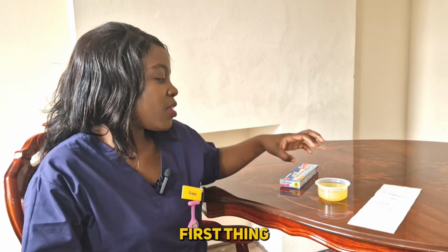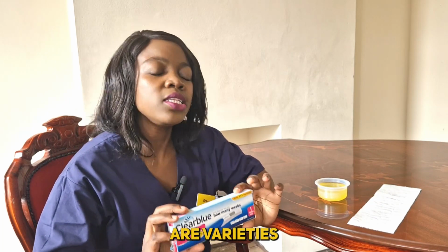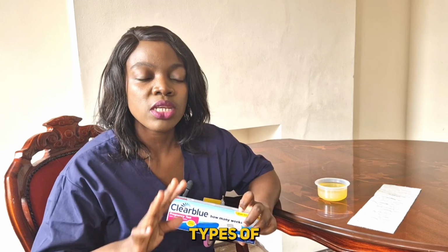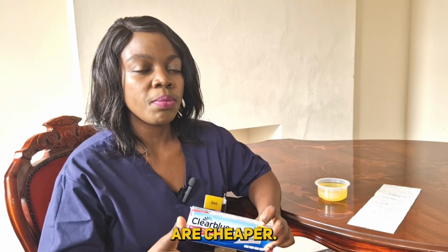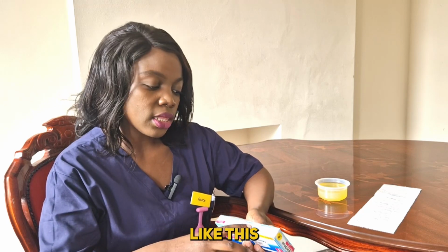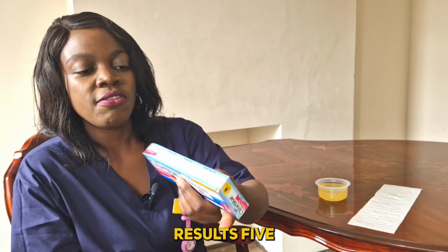So the first thing is that you've got to buy a pregnancy test. There are varieties of pregnancy tests. I'll just be using this Clearblue because it's what I found available. There are different types of pregnancy strips that you can use depending on your pockets. There are those that are cheaper, there are those that are expensive. There are those strips that tell you how many days early you can see results, and there are those like this one, it says results 5 days early, so earlier before your period.